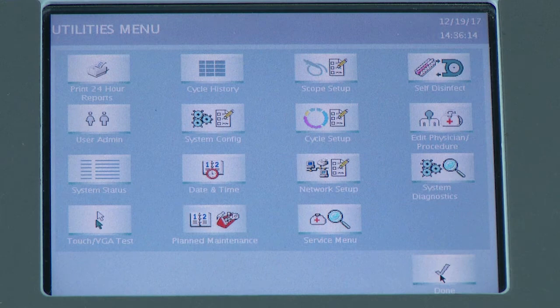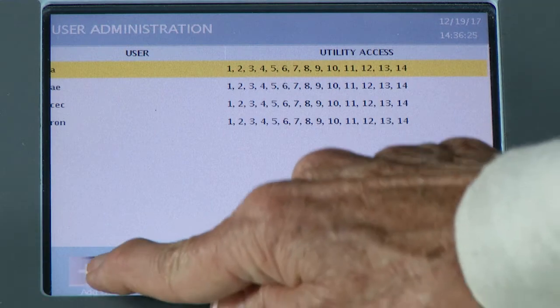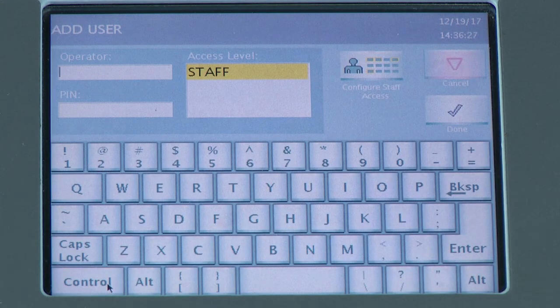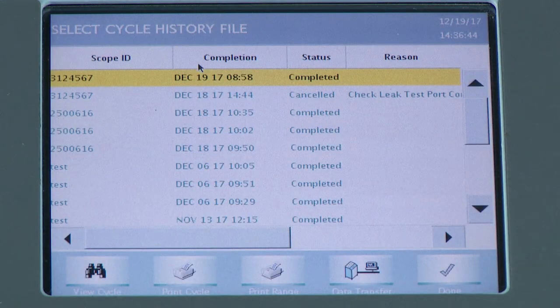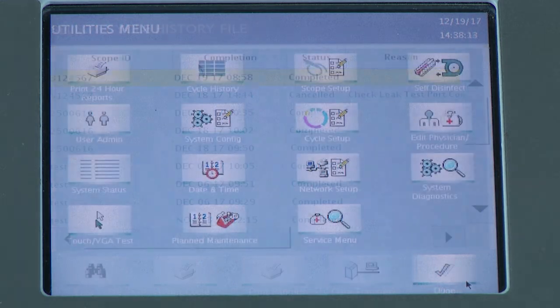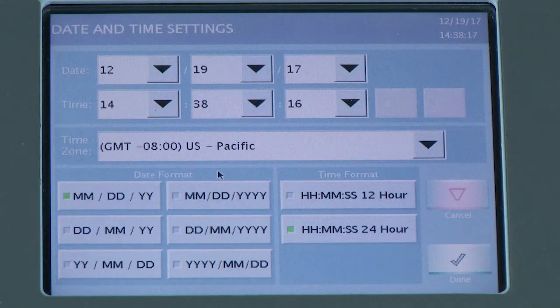The EVOTECH ECR utility screen offers a number of key features. User Administrator walks you through how to add or delete users. Cycle History provides your processed printouts at a glance and allows you to make a copy of the printout when necessary. Date and Time is where you'll check and change dates.